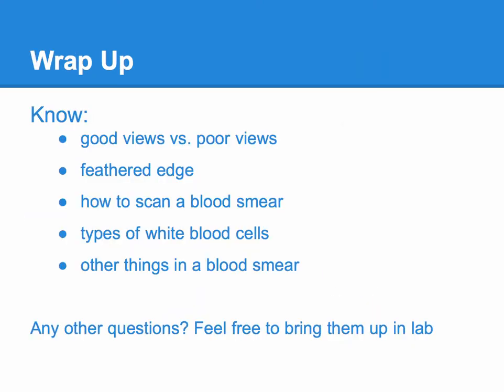To wrap up this video, please remember to know good views versus poor views, know how to locate the feathered edge, know how to scan a blood smear, differentiate the types of white blood cells, and also identify the other things in a blood smear.